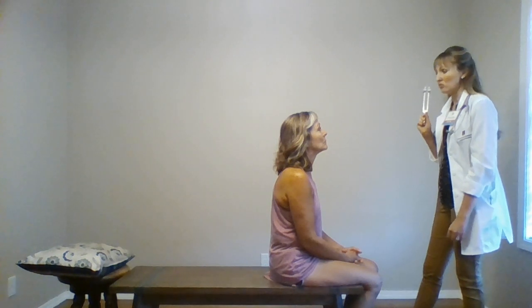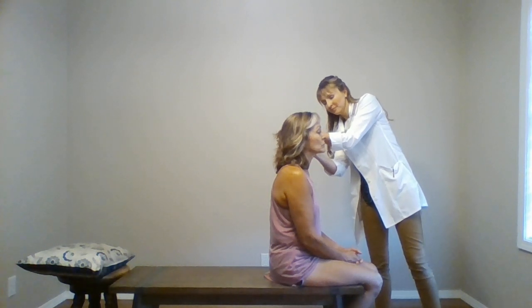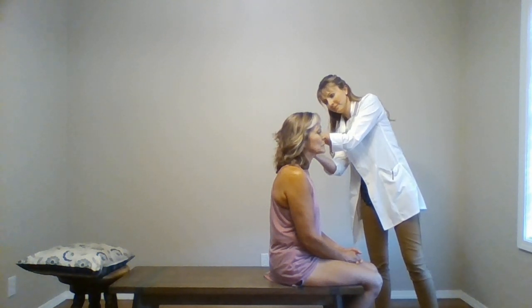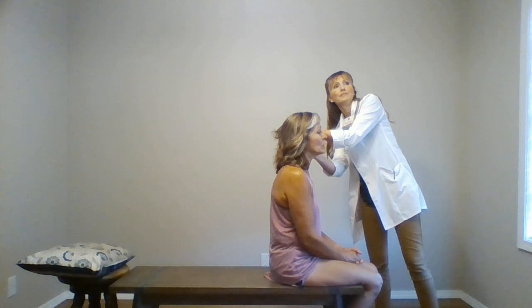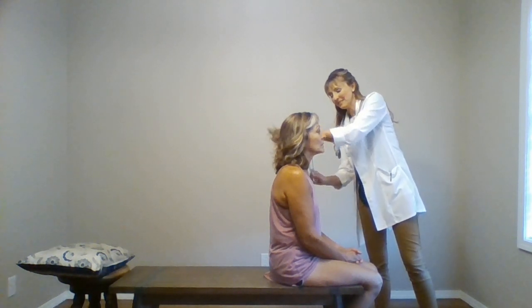It's similar, but this time I'm going to place the tuning fork on the bony prominence behind your ear. I want you to tell me when you can no longer hear the sound, and then I'll move it to the front of your ear, and the same thing, you'll tell me when you no longer hear the sound. Okay. I no longer hear the sound. I hear it. Perfect.